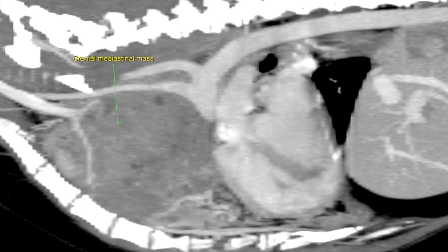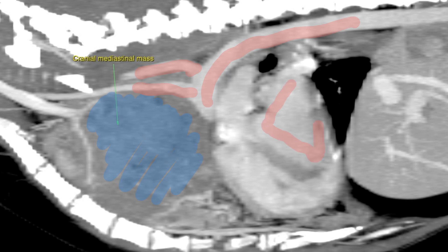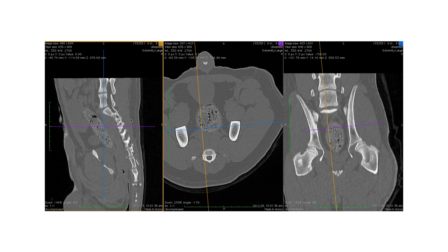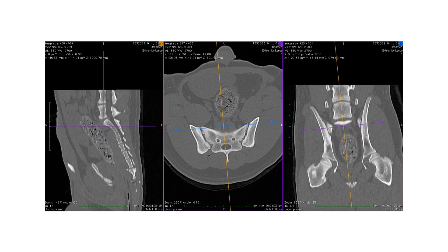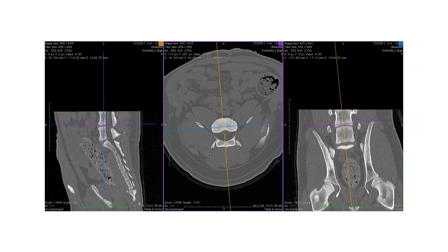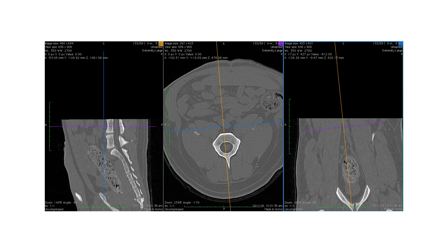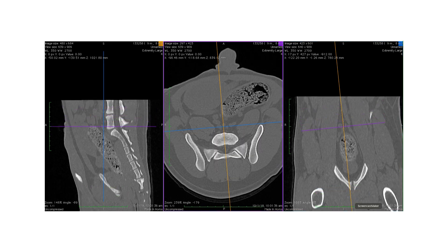This is a sagittal reconstruction of a dog with a cranial mediastinal mass, and we can see the mass sitting here in the cranial mediastinum just in front of the heart. We can very clearly visualize the aorta and the great vessels coming up cranially. We can see the heart with the left ventricle and right ventricle, and we can see the vessels within the liver parenchyma as well. This scan was performed in volume scans — half millimeter slices in all directions — and we can do a multi-planar reconstruction, which allows us to look at all three orthogonal views at the same time.